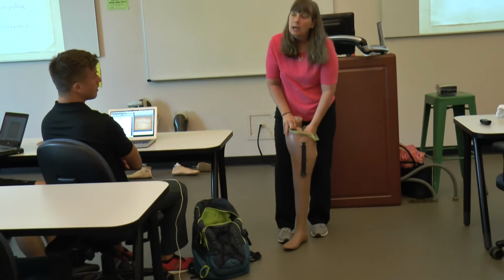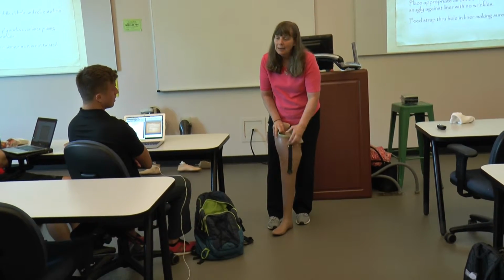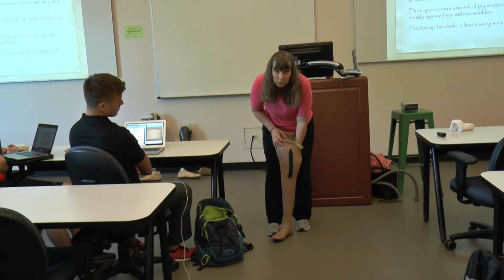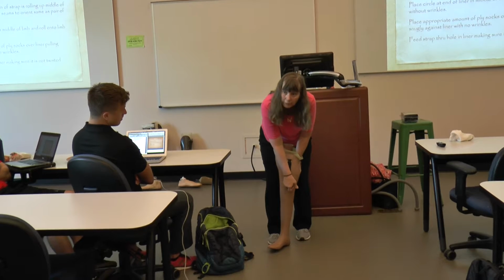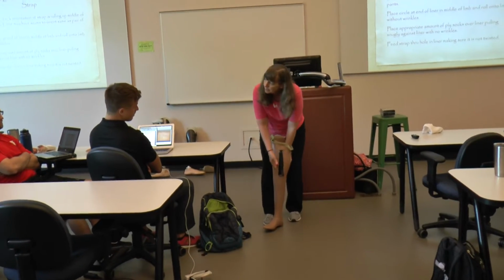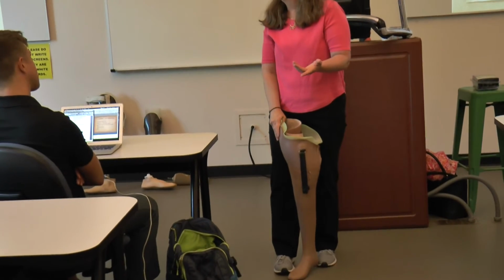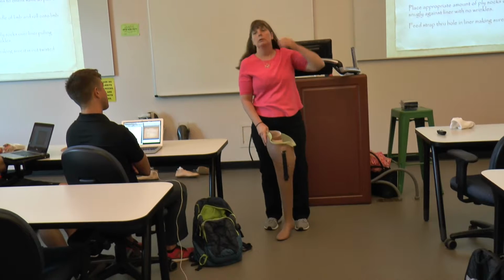Now you're not going to tighten it by pulling off of this D-ring, because if you do, over time, if I stand up and go wiggling into it and try to crank it by tugging it out of the hole off of the D-ring, with time these D-rings start to break and fail. So you want to get them pulling it out of the hole first, then pulling tight, and you can pull down on the D-ring. You don't want to leverage it out of the hole by the D-ring, in other words.